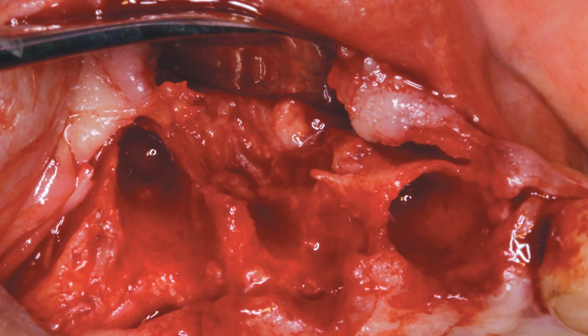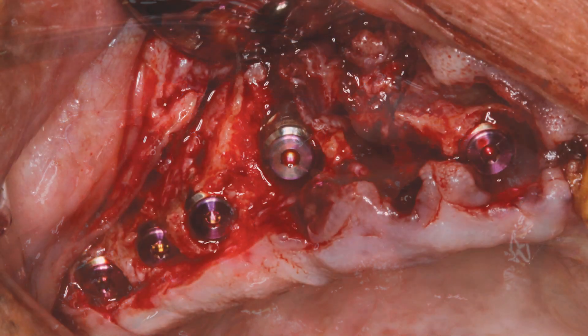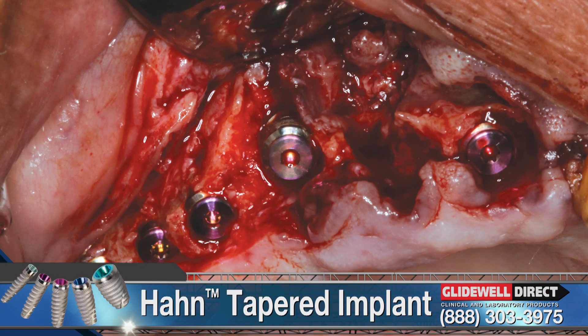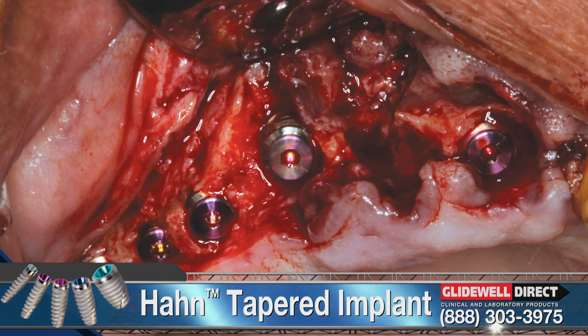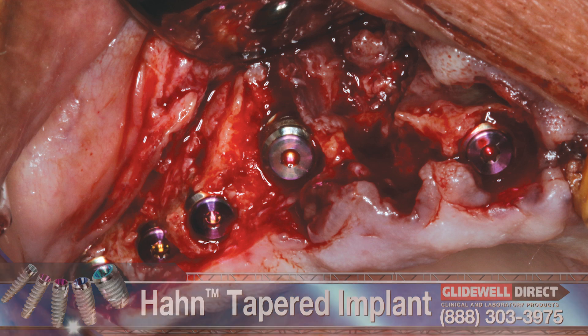The teeth were removed and the soft tissue was reflected to expose the defective bone contours prior to implant placement. I placed five Han tapered implants immediately into the socket sites using the Han surgical protocol.